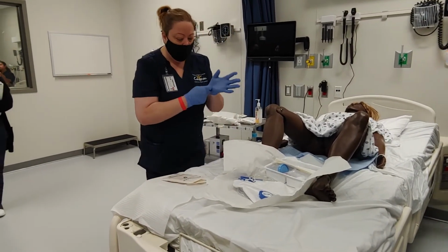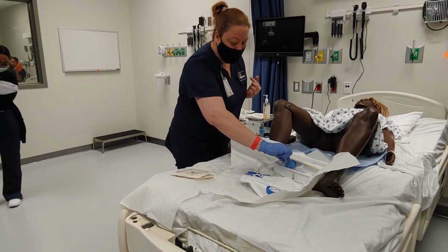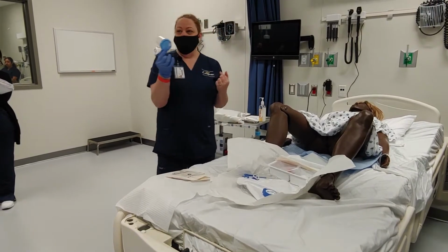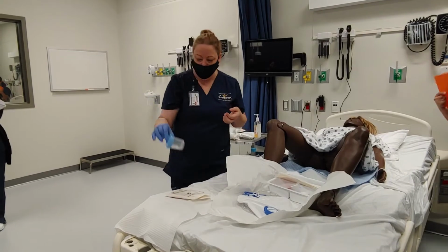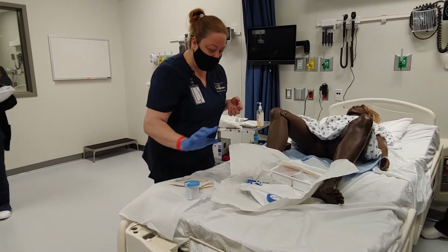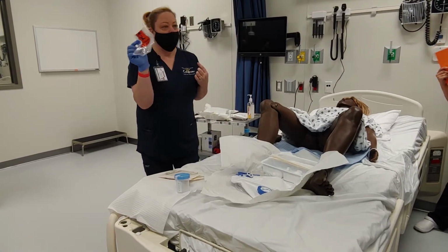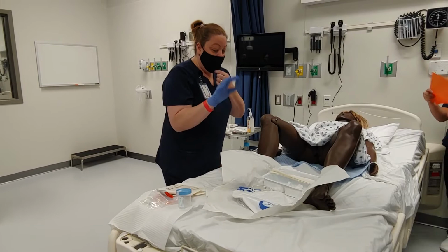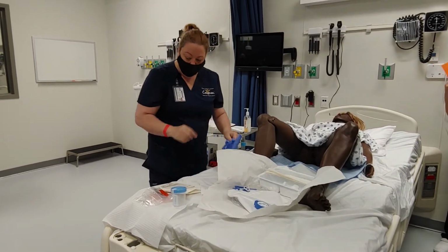Okay, so now I'm going to go ahead and take these off. Before I do that, if I can get it without touching anything inside, do you think this needs to stay sterile? No. The inside, yes, not the outside. So I'm going to set it out here and have it ready to go. Do you think that my transport bag needs to stay sterile? No. So I'm going to set it out there and have that ready to go. Now, the rest of the stuff that's in here needs to stay sterile. So I'm going to go ahead and take that off.